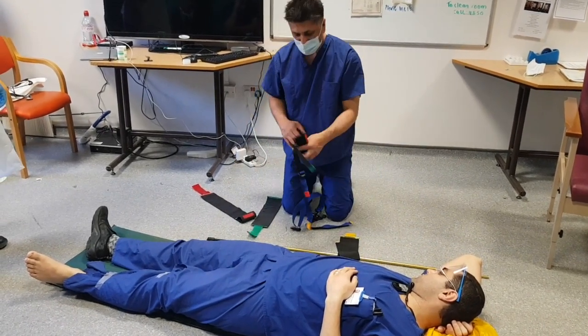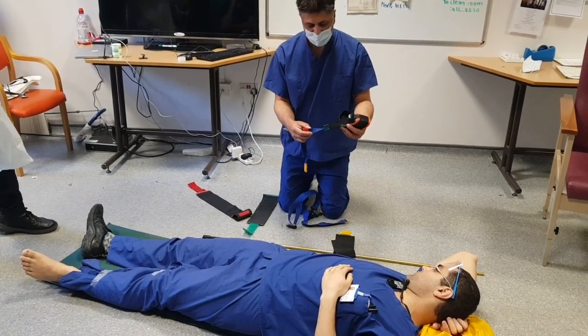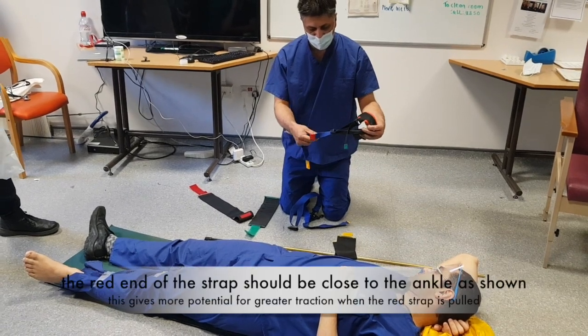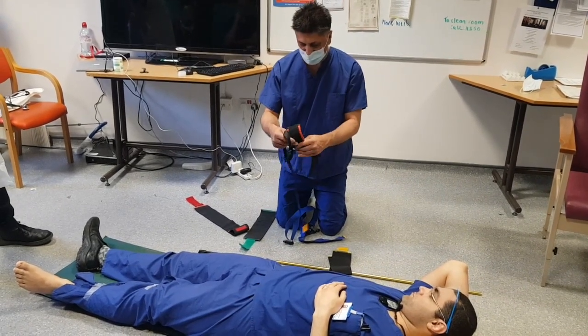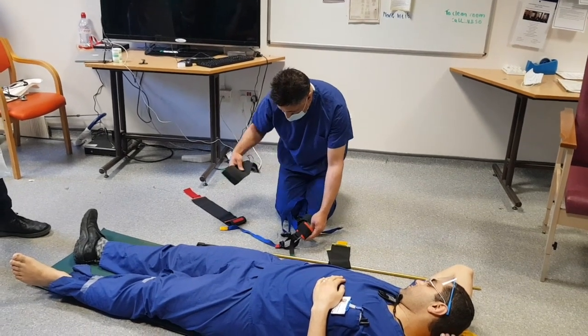There's an ankle strap that will give us our traction on the limb. We want the red end to be as far down as possible to begin with, because we're going to be pulling on that to get our traction. We've also got these external straps.